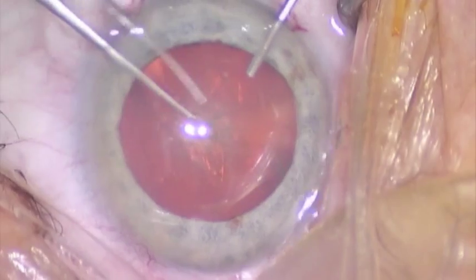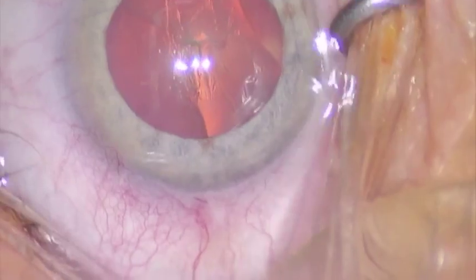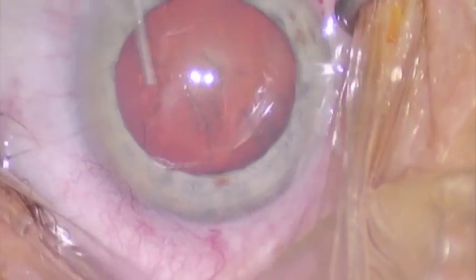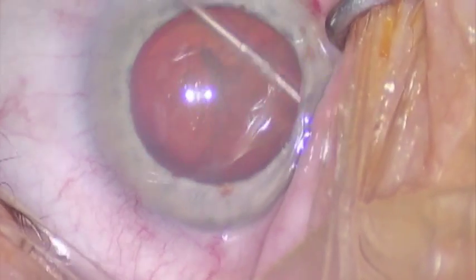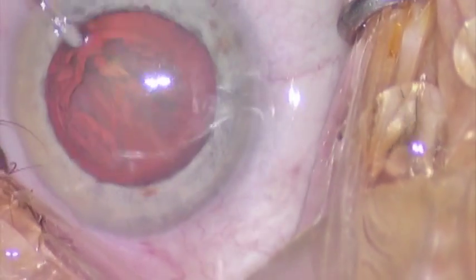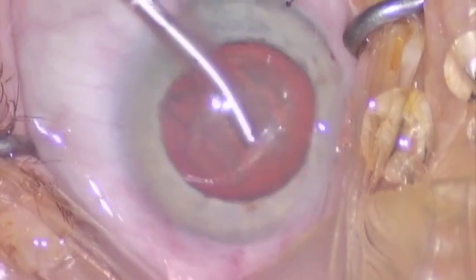So in this technique, here we are doing the rhexis, we start out normally, we'll do the hydrodissection — in this case it succeeds — but let's say for instance we have zonular dialysis or hydrodissection that we can't achieve. The technique is very useful. We basically form a first groove. Using the phaco, this is a 2.2mm incision in this example.